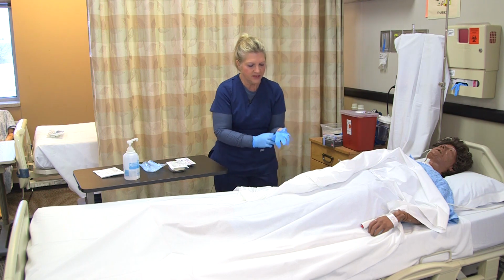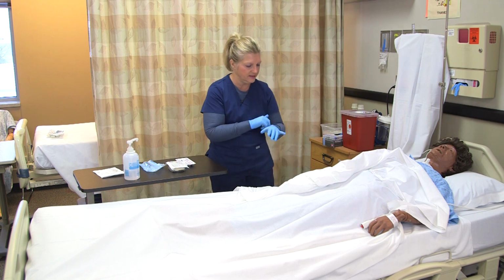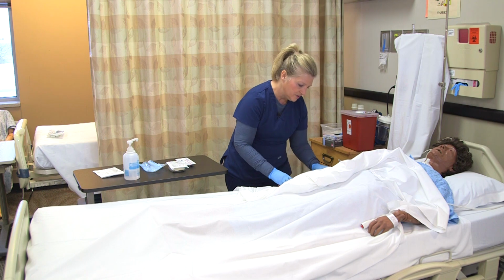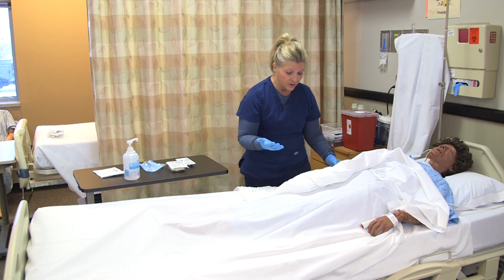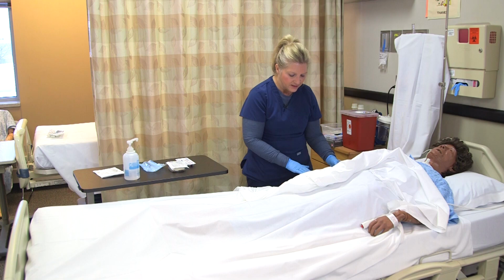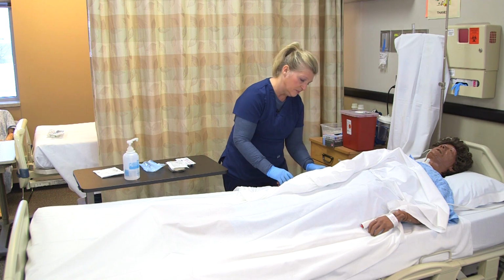I brought all my supplies in the room with me, and I checked expiration dates on the supplies, and everything is good to go. All right, so as I look at the patient's arm, I'm noting that this patient is darker skin colored, so a lot of times you want to have bright light when you're looking at patients with dark skin. Fluorescent light is the best, but bright light if you don't have fluorescent light, because you're able to see the veins a little bit better.